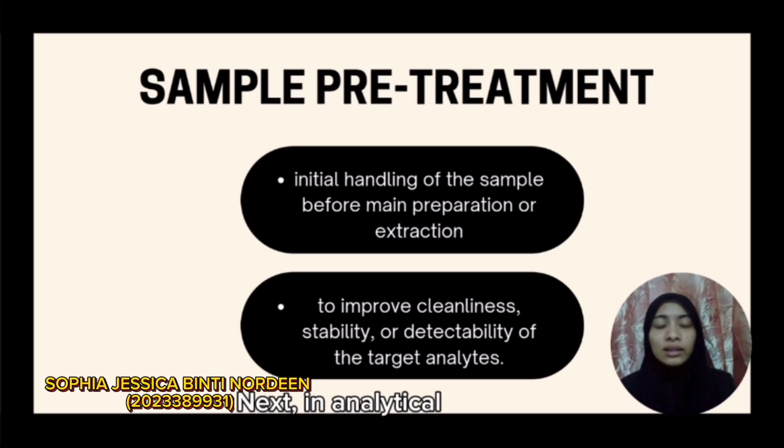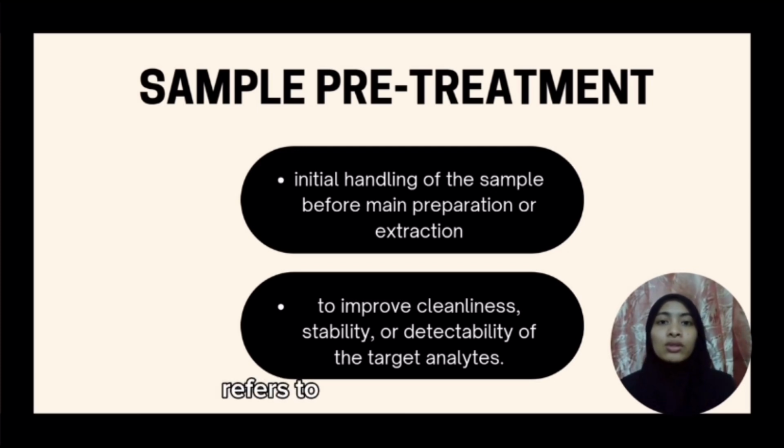Next, in analytical chemistry, sample pretreatment refers to the initial handling of the sample before the main preparation or extraction, typically to improve the cleanliness, stability, or detectability of the target analyte.